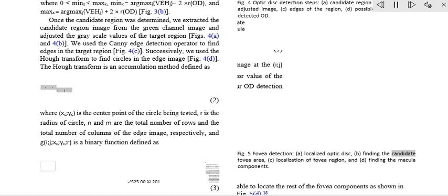After segmenting the blood vessels, we created 4 masks to extract the ISNT regions. We calculated the area, major and minor axis lengths, eccentricity, orientation, Euler number, circle diameter, solidity, extent, and perimeter properties of each region. In addition, high-quality retinal images should have a uniform vessel distribution among these quadrants. Consequently, we calculated 2 additional features from the ISNT quadrants, which are given in the following formulas, 4, 5. Figure 6 shows a graphical representation of the ISNT features.